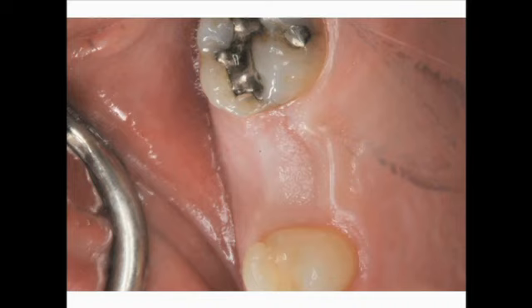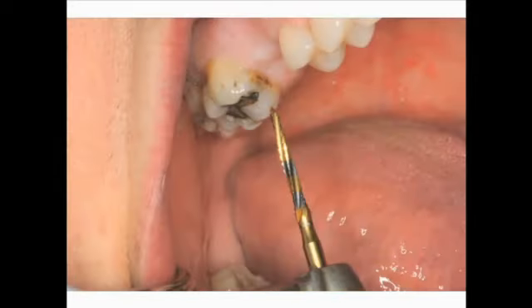Just looking at the soft tissue intraorally does not necessarily give us the exact amount of bone that we have to work with, because there can be a significant amount of soft tissue. The Cybron implant system is simple and precise, and we're going to demonstrate the surgical technique in the following slides. The first drill used to initially determine angulation is the Lindemann guide drill.